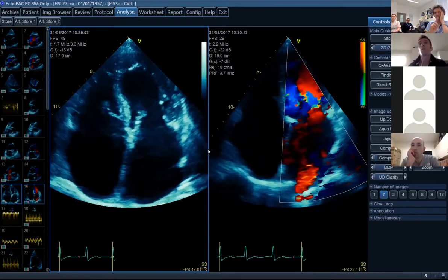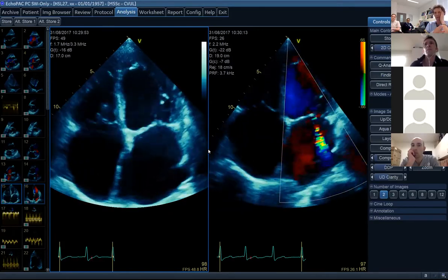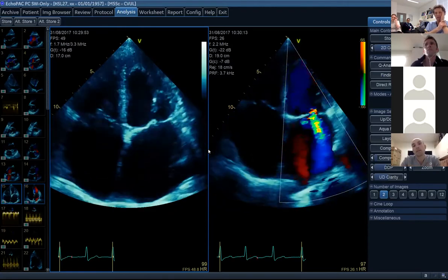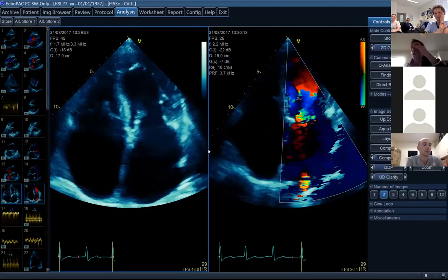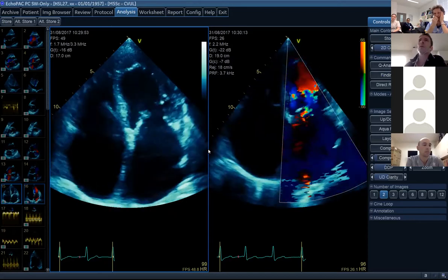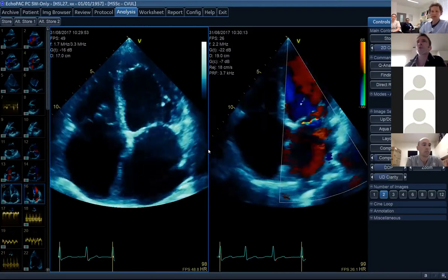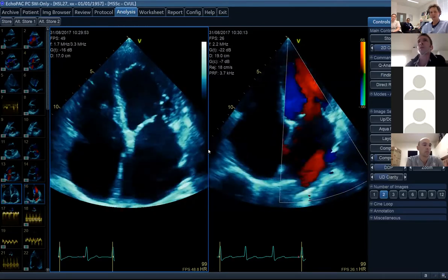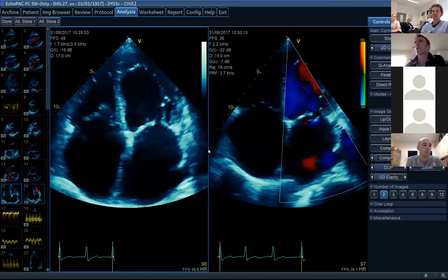The other thing you were talking about was this mitral regurgitation that worries you. Let's delve into it more. I completely agree with you, but you said you thought it was moderate. But why? Tell me a bit more about why this is worrying you. Sorry, I'm trying to follow the clips here on the 2D. I would assess for any morphology abnormality of the valve, which I don't see much of. Yeah, fantastic. I agree. You're on exactly the right track.